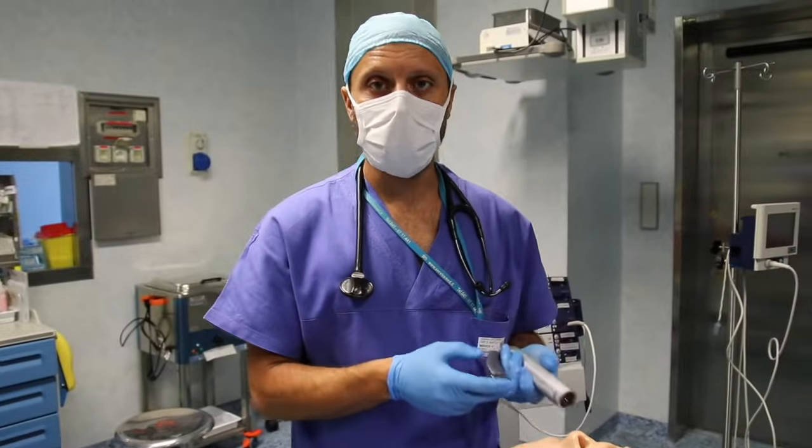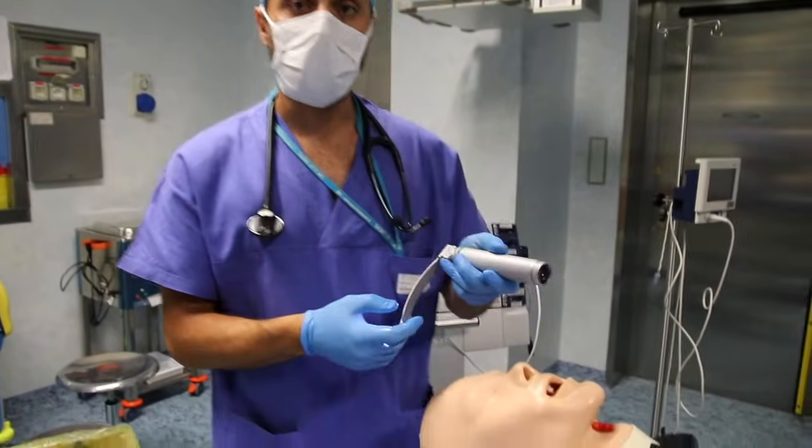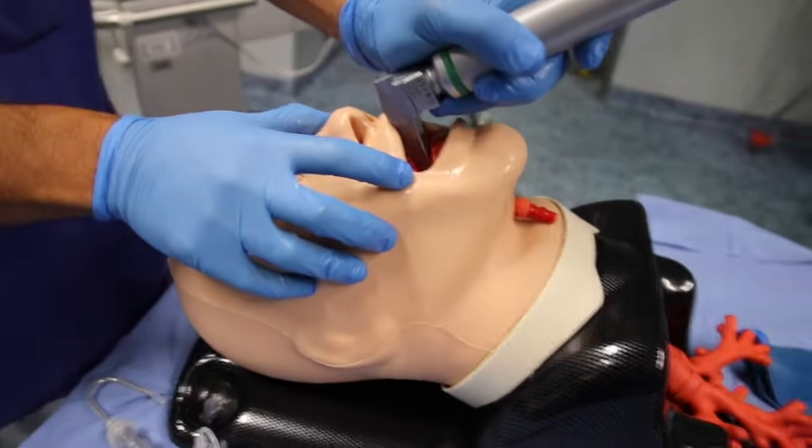In case of difficulty during blind insertion, you can help yourself with a laryngoscope to get a clearer view. Take the instrument and proceed with the laryngoscopy.